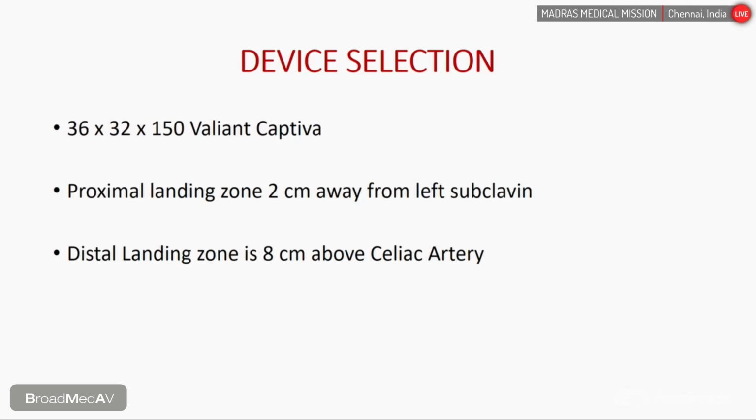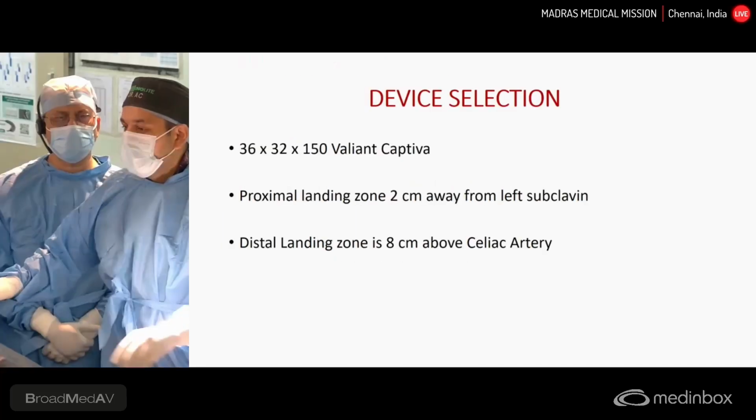One, the anesthetist has taken the left radial access. We have taken the right femoral artery and the left femoral artery, common femoral. Both were done with ultrasound guidance. Then we had a 6 French sheath left on the left side, and a 6 French sheath was also put on the right side. 3 ProGlide sutures were placed in position, and now we are live for you from here onwards.